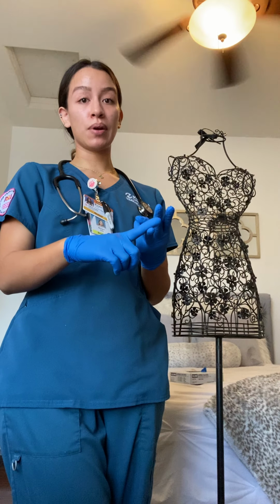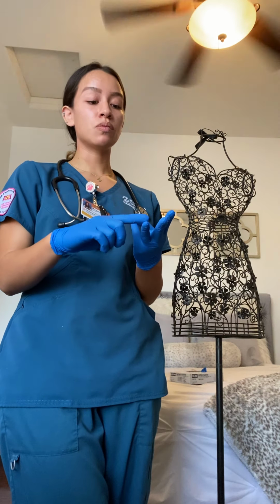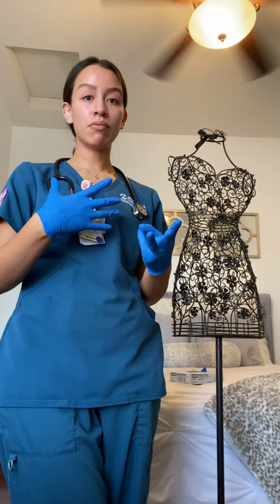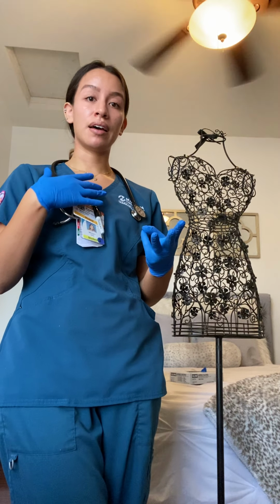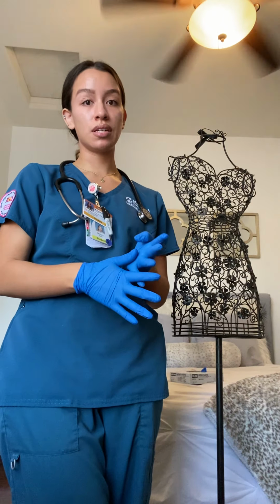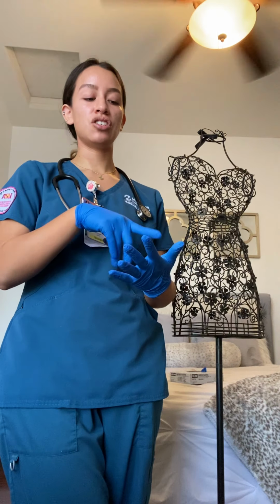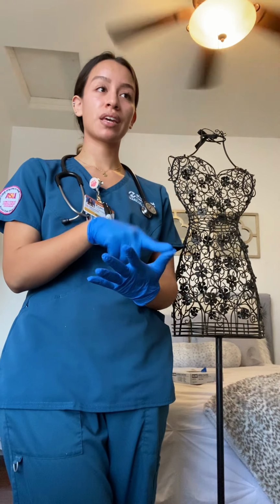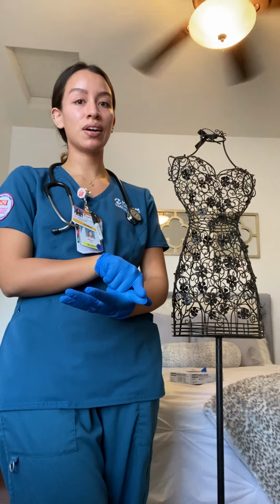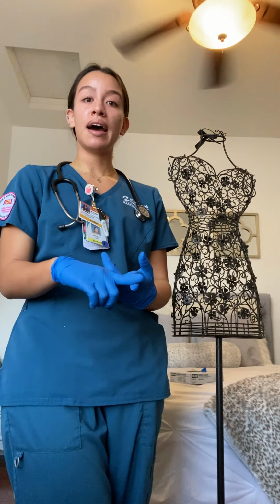I want to assess respiration rate, make sure it's within normal limits of 12 to 20 breaths per minute, as well as checking the depth, the rate at which she's breathing, if she's using any accessory muscles, if it's labored, etc. I want to assess her temperature, if it's elevated, anything like that. Check her pulse ox. I want to check her oxygen saturation, make sure she's properly oxygenated, as well as her pain.